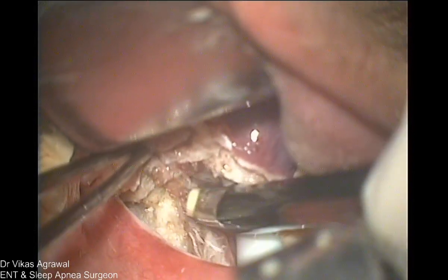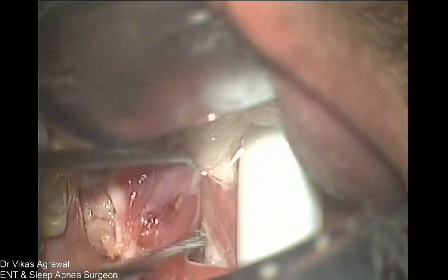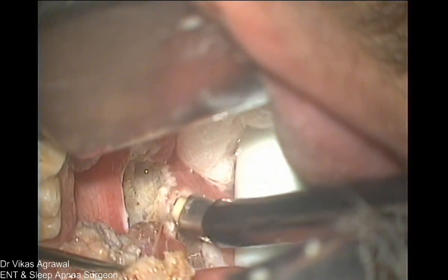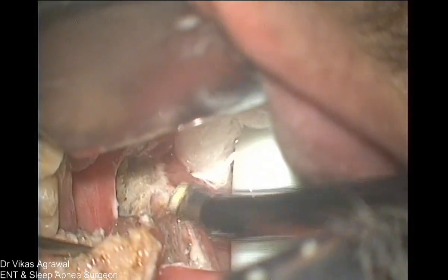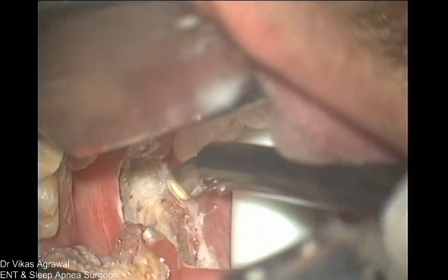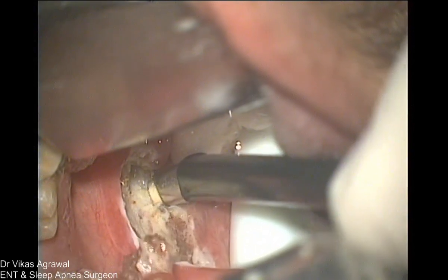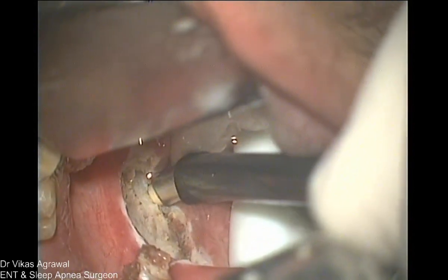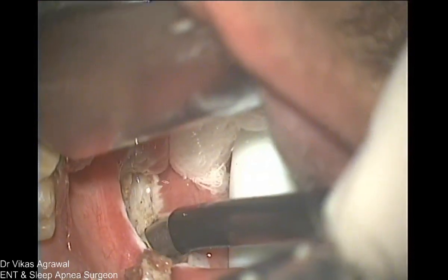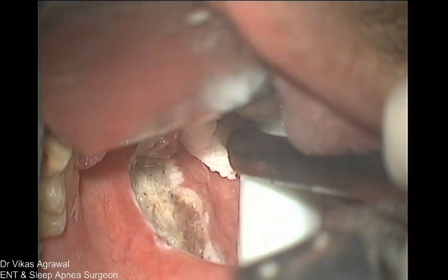Now see, these are the vertical fibers which I am coagulating. Yes, seen very well. Excellent. These are the fibers which we have removed. Now this is the vessel I was talking about. Sometimes this can be very big. You saw that? Go right at the back of this vessel. Not only the tip. If you only coagulate the tip, then it can open after 8-10 days. If you also coagulate the course of the artery, then it will not open up.